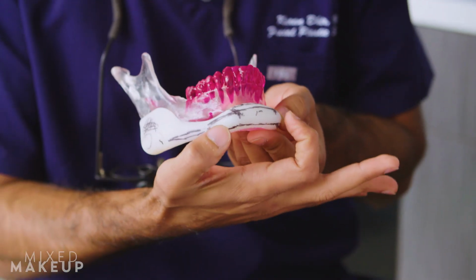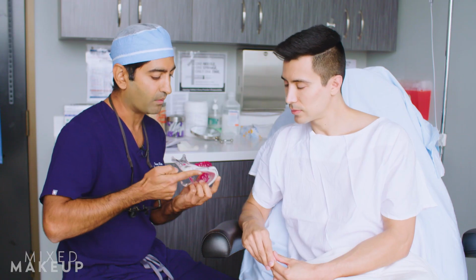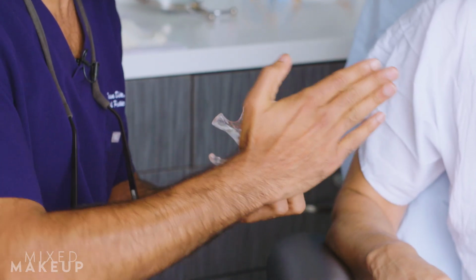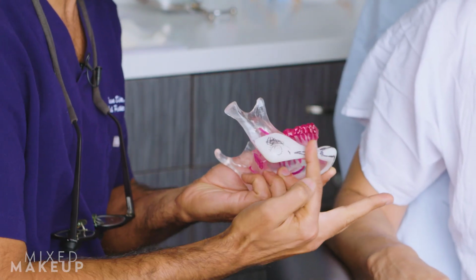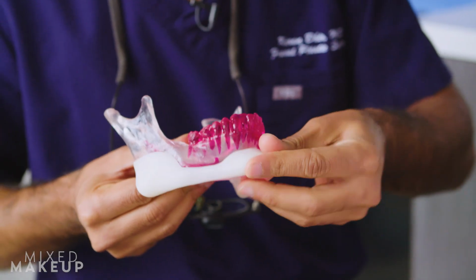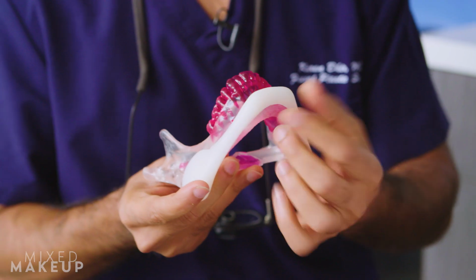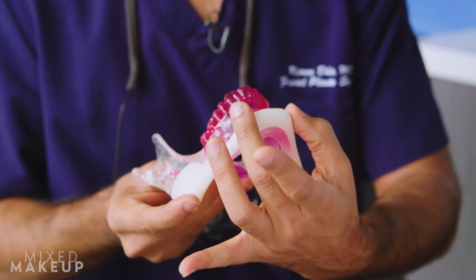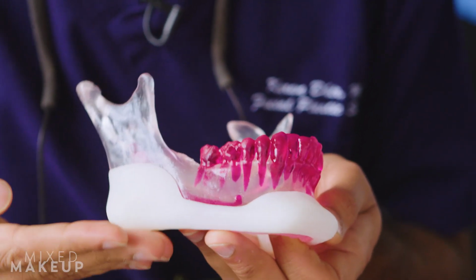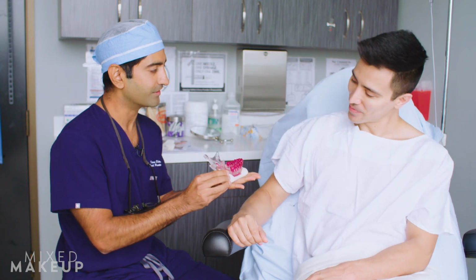And you and I had a nice chat. This was too square, we brought it down. We wanted this to be a little bit bigger, a little bit more defined. We wanted that concave, that kind of swoop, but a little bit more strength here. We finally got it exactly right, and this is the implant that we accepted. You and I love it. So we'll let you look at it one last time. We got that squareness, a little bit more weight here, we got the angles, we have a chiseled look, we lowered the jawline a little bit, and this is your new implant. So this is what it's going to be.